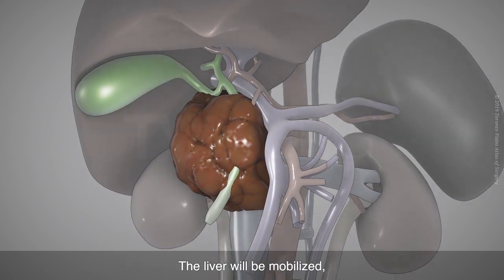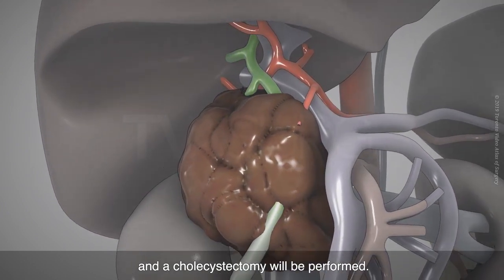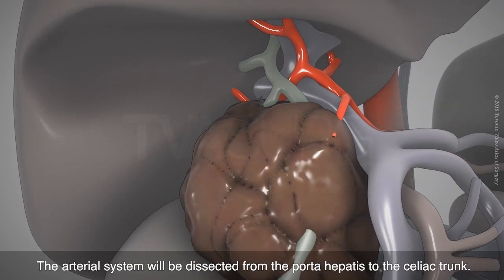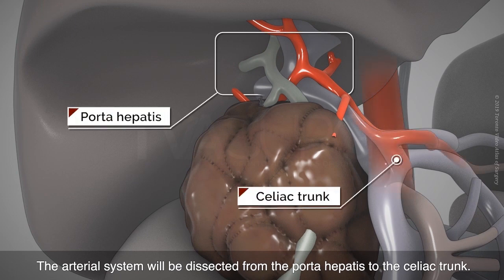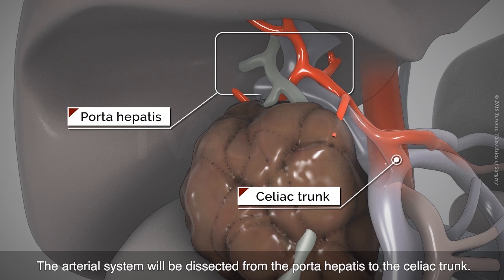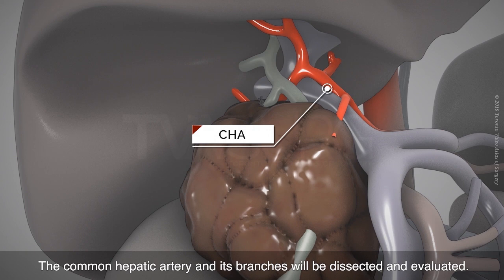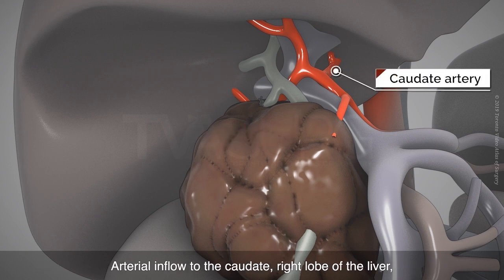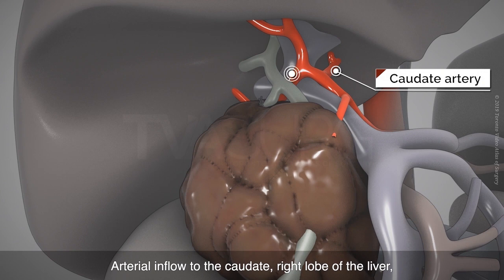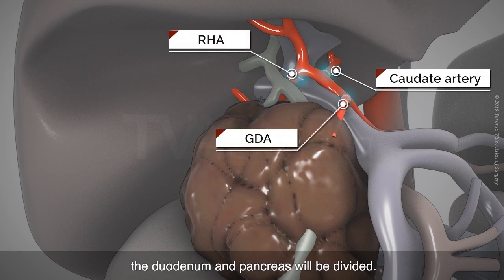The liver will be mobilized and a cholecystectomy will be performed. The arterial system will be dissected from the porta hepatis to the celiac trunk. The common hepatic artery and its branches will be dissected and evaluated, and arterial inflow to the caudate, right lobe of the liver, the duodenum, and pancreas will be divided.